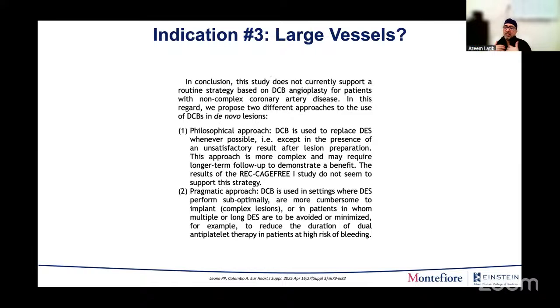This technology doesn't have to replace stents for it to have a role in what we do every day, right? And I think when you start going too extreme, that's when you're going to start seeing the negative consequences of any technology, right? And we've seen that before. So to me, you have a focal proximal LAD lesion, you can put a 28 millimeter, 3.5 millimeter drug-eluting stent in. There's nothing wrong with that.